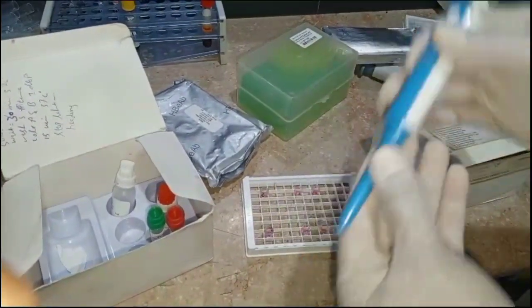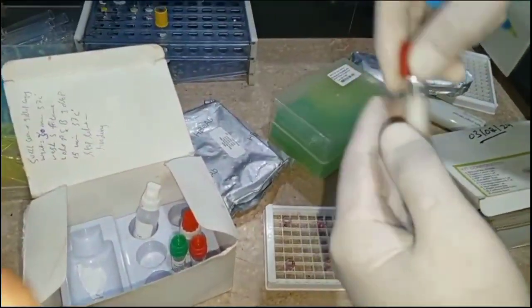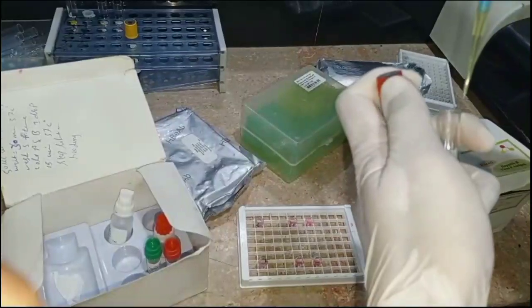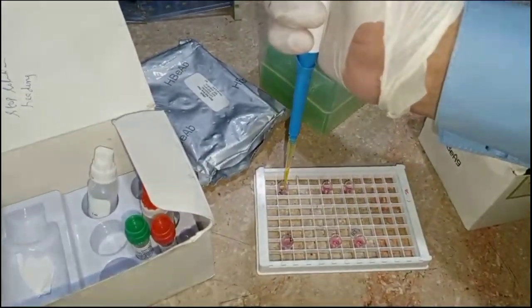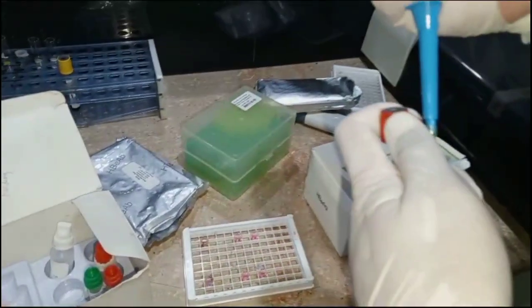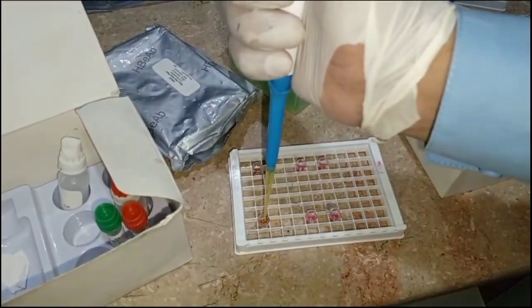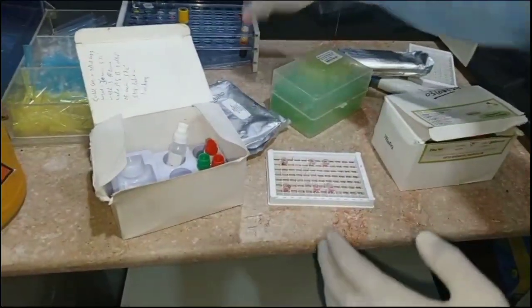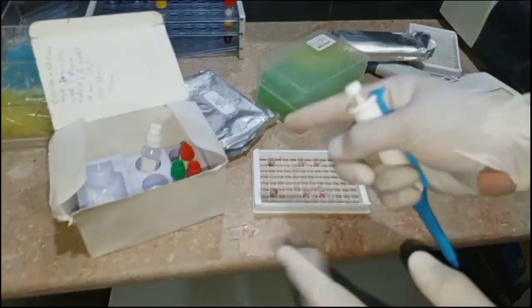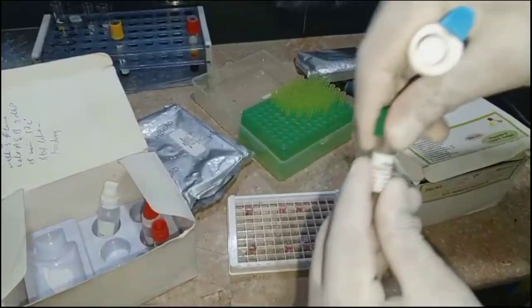After that we should take 50 microliter of the blood serum, and we'll add it into the first well of the HBeAg and HBeAb that is acting as a test. Next, in the second well of HBeAg and HBeAb, we should add the positive control. So we should add 50 microliter of the positive control in HBeAg and Ab of the second well.